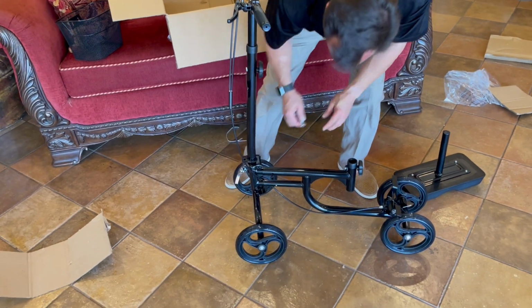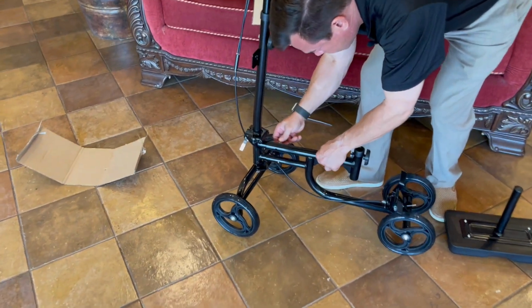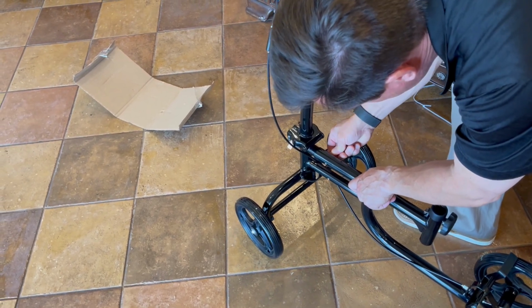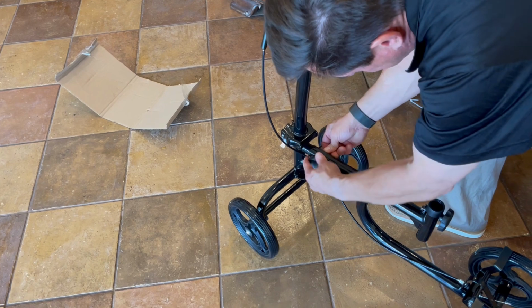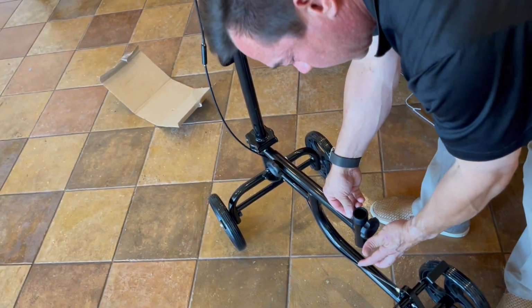And once again, we take our hexagonal head screw and slide it into place, like so. You want to make sure these are nice and tight on there. It gives you a nice, easy way to find out how tight it is.